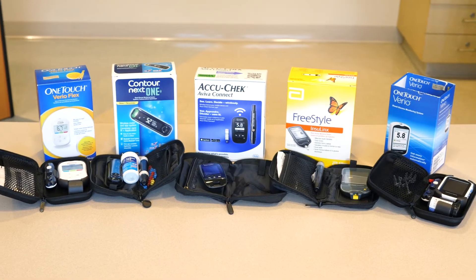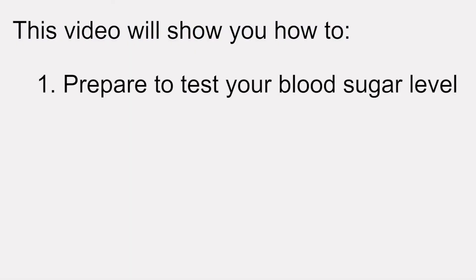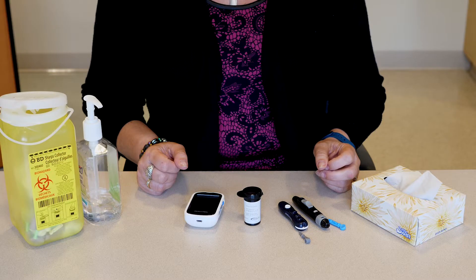Many Canadians need to test their blood sugar levels every day. This video will show you how to prepare to test your blood sugar level, lance your finger and draw blood for testing, and use your blood sugar meter.